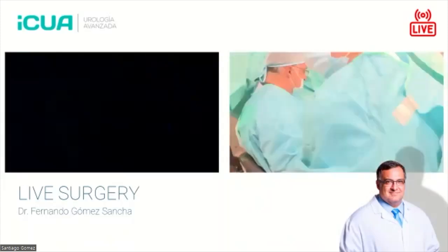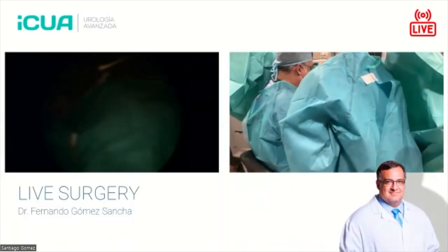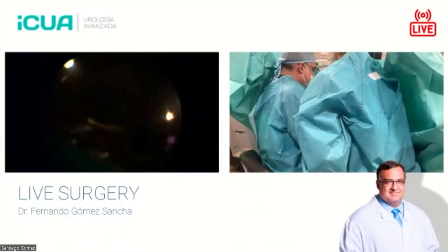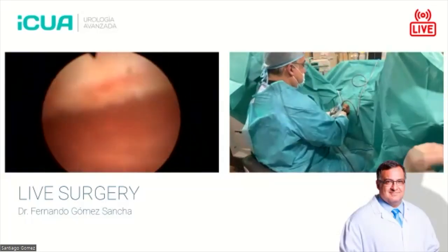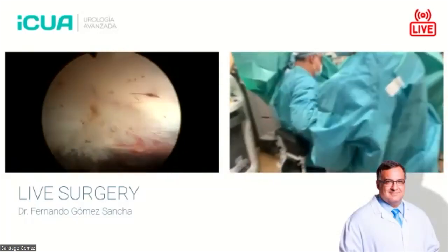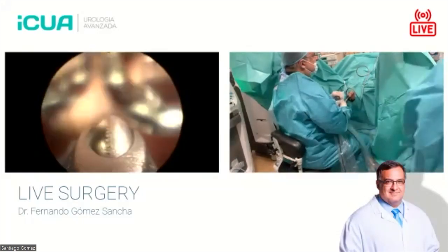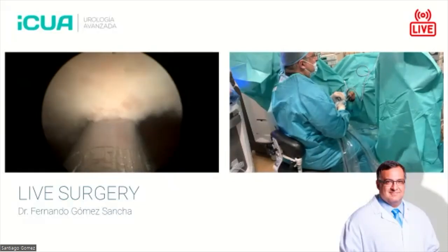Okay. So another aspect that is paramount is that you cannot do HoLEP alone. So you need to have a good team that supports you. Here I'm changing the instruments. And in order to do these things fast, you have to rehearse these movements, and you have to have a good team that supports you.